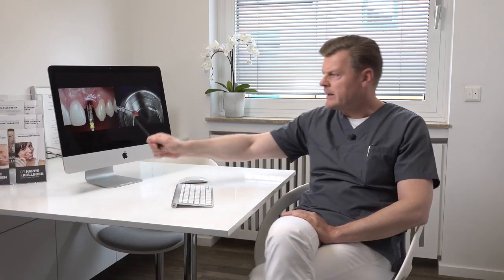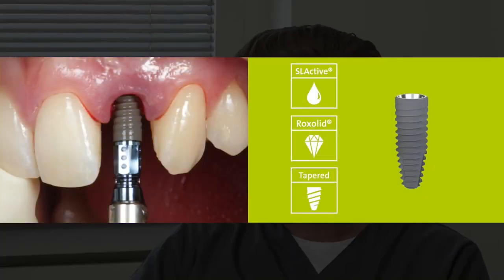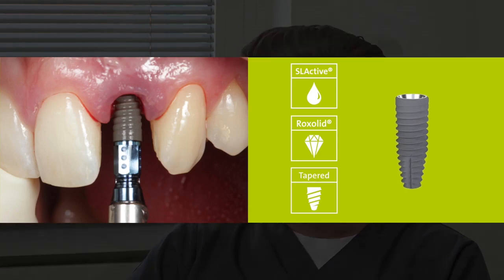We place the implant and do the drilling in the palatal wall of the socket, then try to engage the implant in the palatal wall. In this case we placed a BLT SL active implant of a diameter of 4.1 and length of 14 millimeters, and we had a primary stability of over 35 newton centimeters.